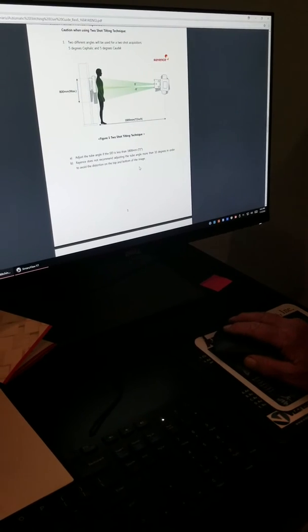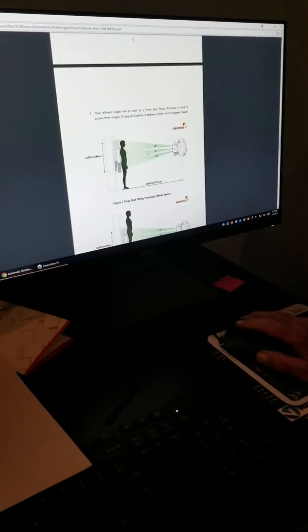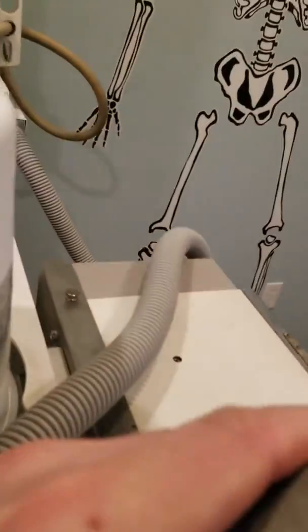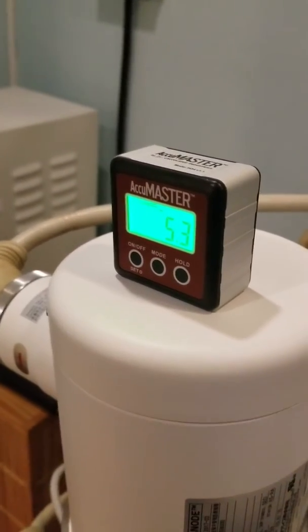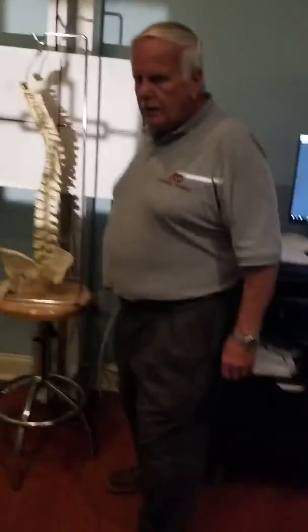Does it show a lateral version by any chance? Okay, yep. So this time we'll be doing 5 up and 5 down. So no 0, but we'll take it to 5 degrees up. And we'll orient our patient that way.